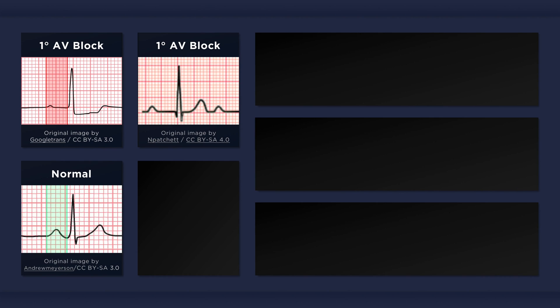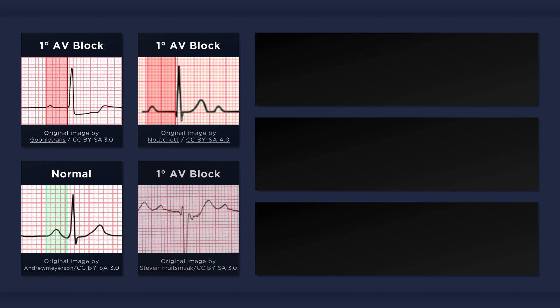Here's another example of first degree AV block. The PR interval is about 8.5 little squares in duration, which equates to 0.34 seconds. And in this new ECG below, the PR interval is about 7.5 little squares in duration, which equates to 0.3 seconds.